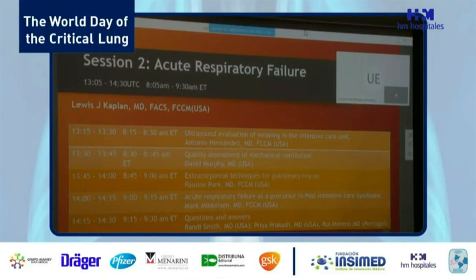Now, when you compare it to diaphragmatic thickening, there seems to be a little bit better predictive value there with the thickening. So there's some evidence perhaps to suggest that this might be beneficial to you. So I would say yes, it is another tool for us to become accustomed to, and it is really becoming popular. As for whether other providers, in general, I think so. Definitely, this is a tool that should be used by everyone.